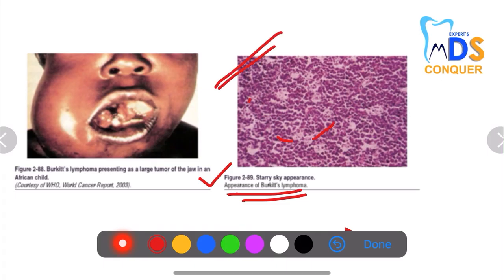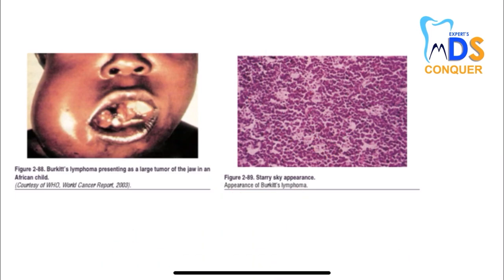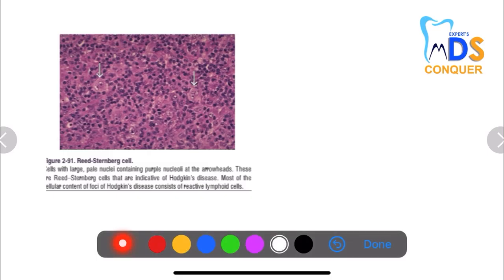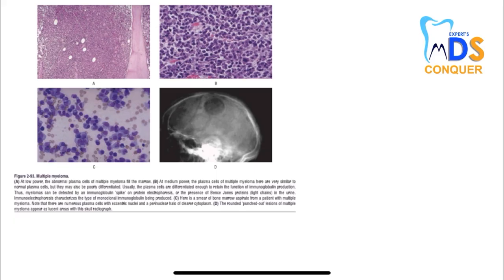Here you can see the starry sky appearance, which is a unique histological feature of Burkitt's lymphoma. Next, the Reed-Sternberg cell is a unique feature of Hodgkin's disease, where you can see cells with large pale nuclei containing purple nucleoli. This is indicative of Hodgkin's disease.